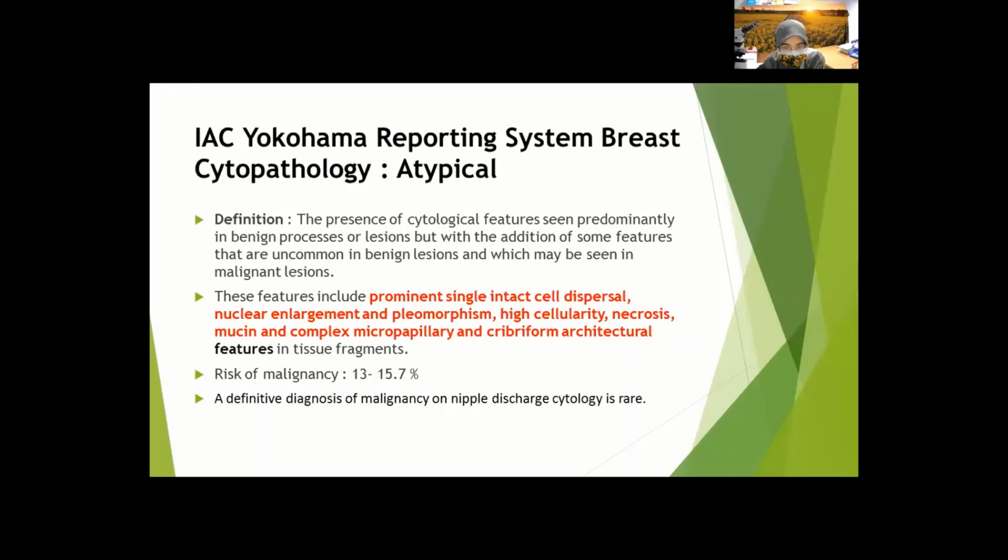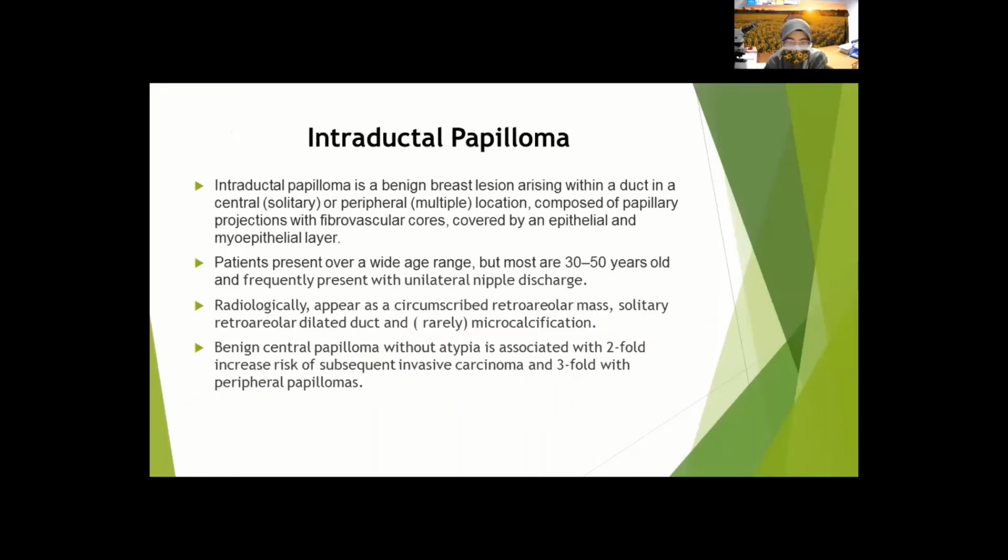And the risk of malignancy for atypical is about 13 to 15.7%. However, a definitive diagnosis of malignancy on nipple discharge cytology is rare. Usually we just comment on atypical.